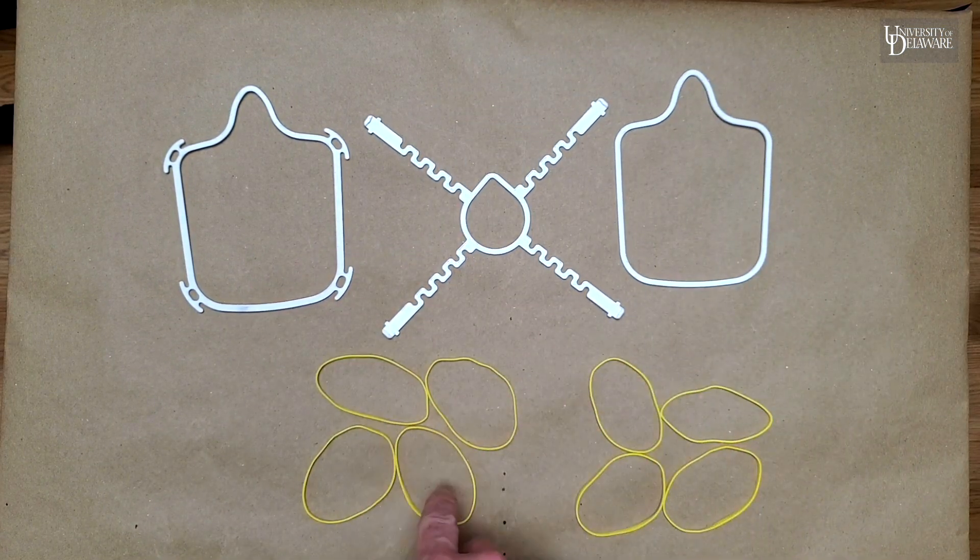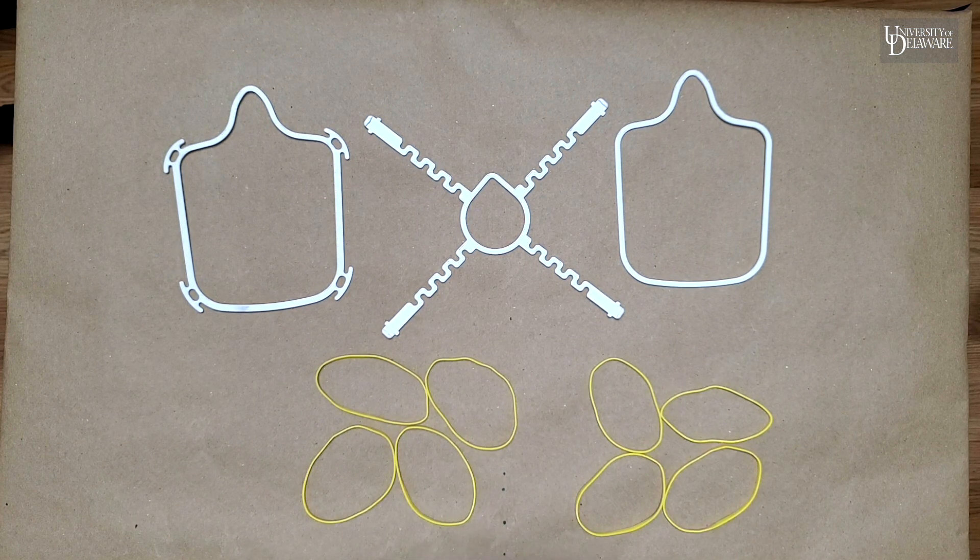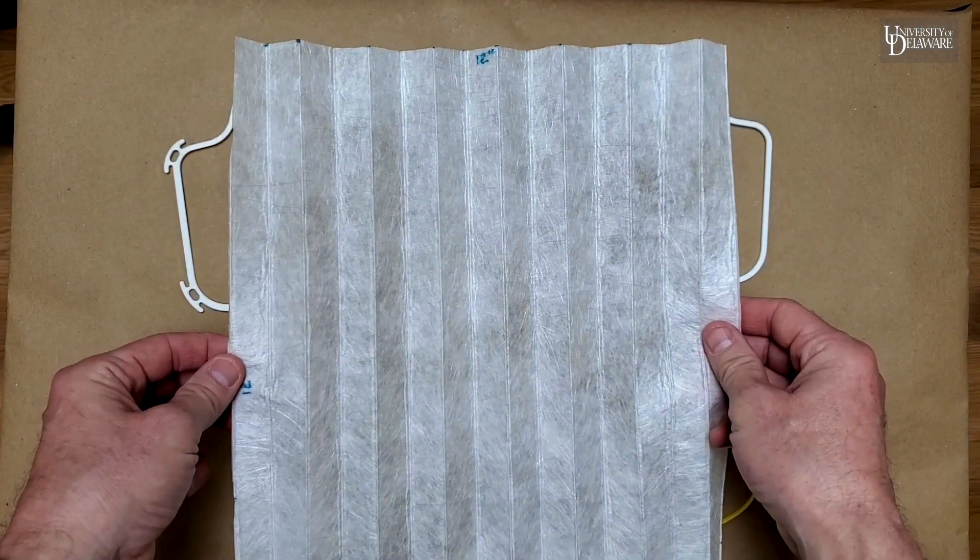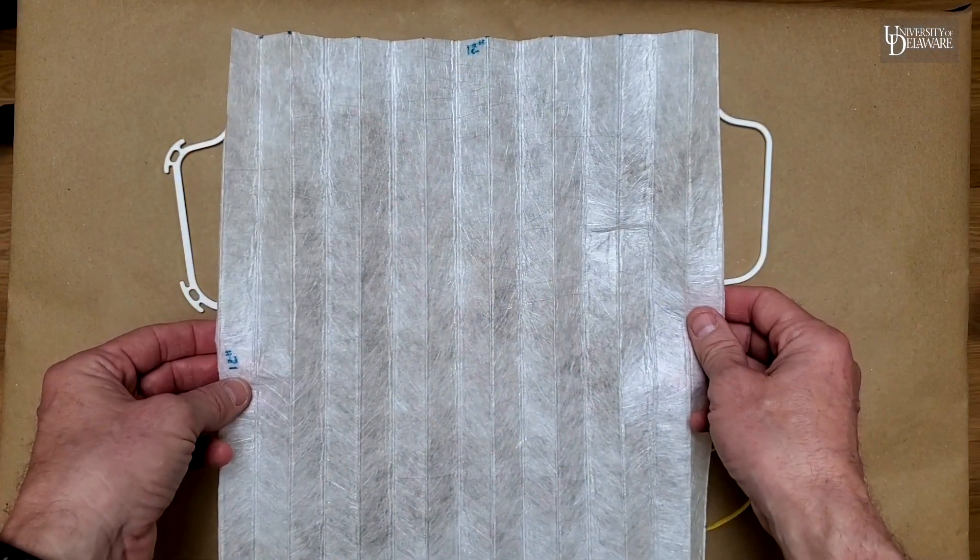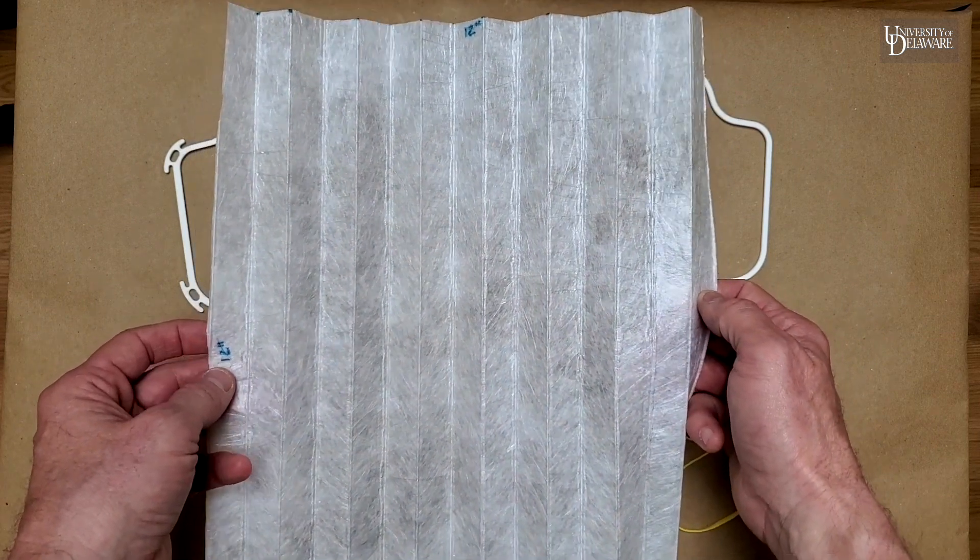And then we have two sets of four bands that we're going to fashion into a strap to hold this onto your face. And the last piece is a swatch of filter material, 12 inch by 12 inch. This is from a HEPA furnace filter.